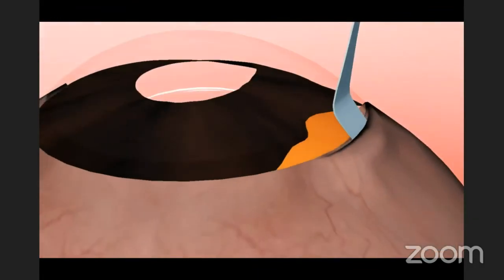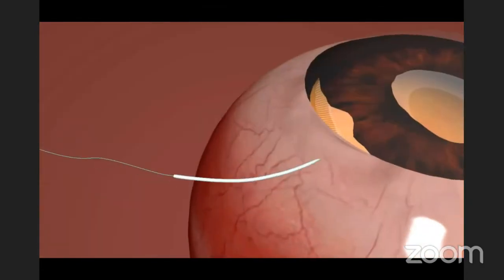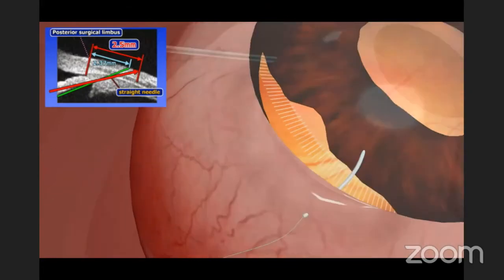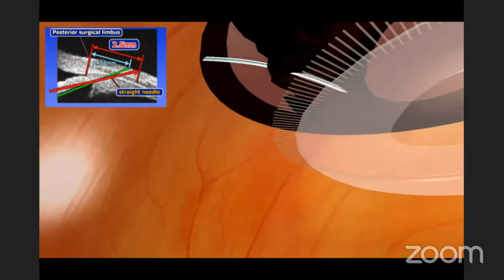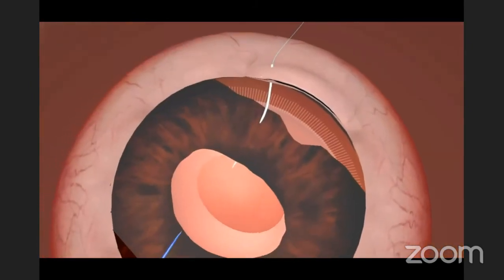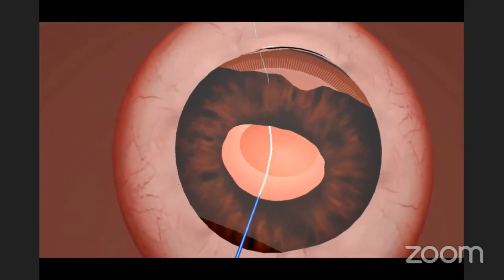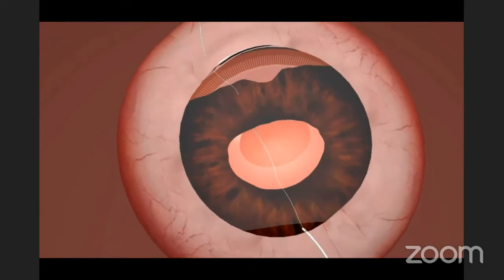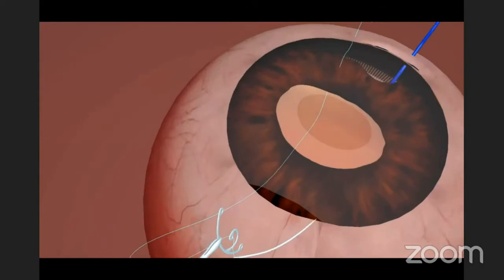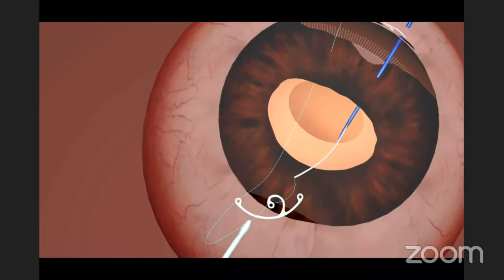A Hoffman pocket is made adjoining the area of dialysis. The needle is passed across the pocket just in front of the ciliary body at the ciliary sulcus, through the peripheral torn iris from outside inwards, and brought out of the eye by railroad. It is passed through the eye of the segment CTR. The suture is guided out through the scleral pocket by passing through the peripheral iris from inside out.